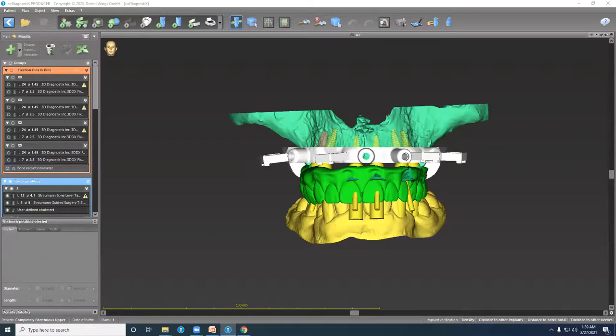Actually, that's a very good question. The guided bone reduction will be done to make sure that you have a flat level or a plateau to achieve the best leveling for the bone. And then afterwards, you might have the implants planned a bit subcrestal to that level in order not to expose these implants. You should follow the implant manufacturer recommendations. So as mentioned here, the GM implants should be placed 1 millimeter subcrestally. And as we do that, we'll need to do some crestal bone profiling freehand after removal of the surgical guide and before placing the abutments. I hope this answers your question. Let's move on to the Straumann guided surgery instructions.